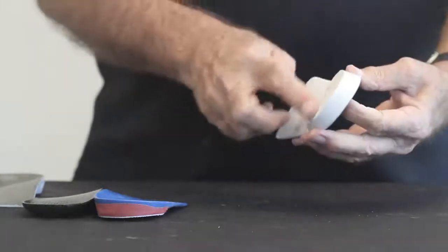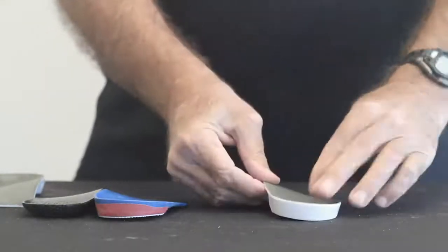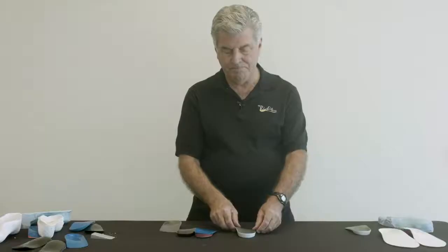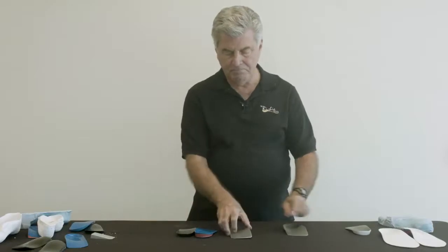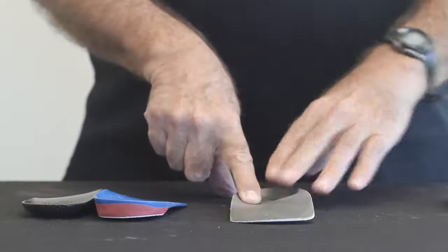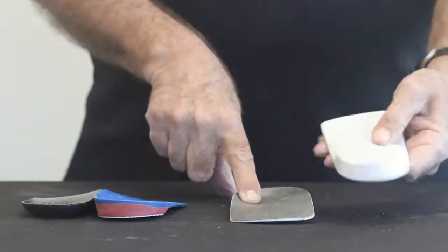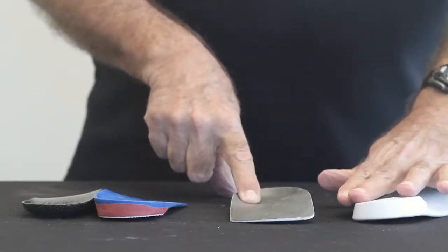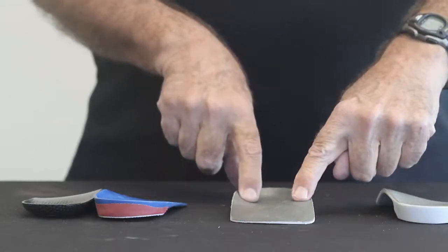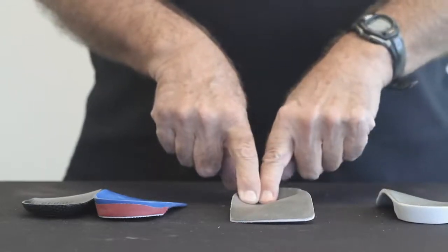It has another feature in that it has two planes of contact. On the lateral side of the post, there is a bevel — a different angle of plane than on the medial side. This particular orthosis is inverted four degrees.